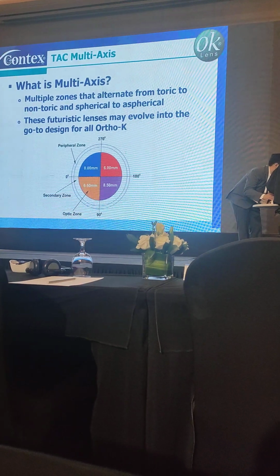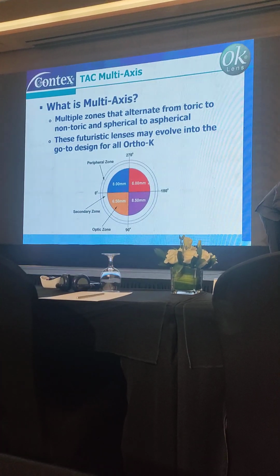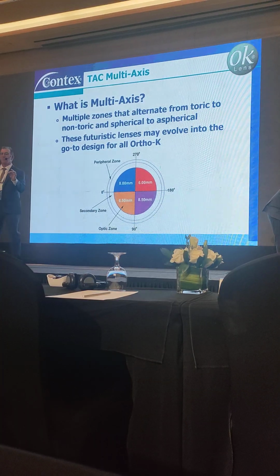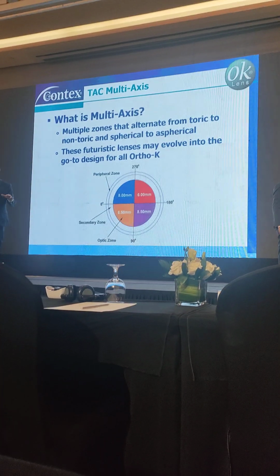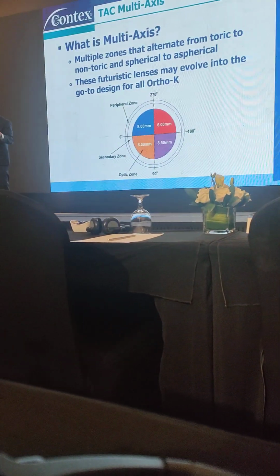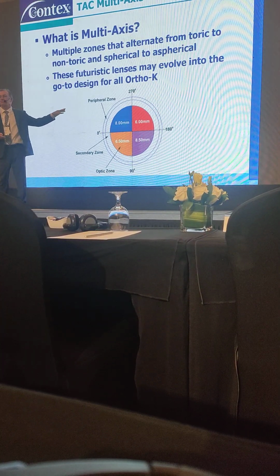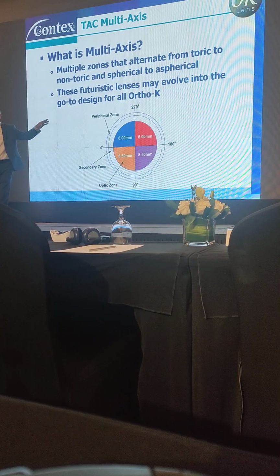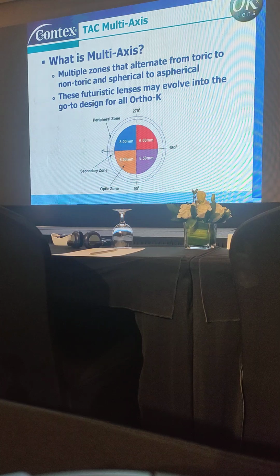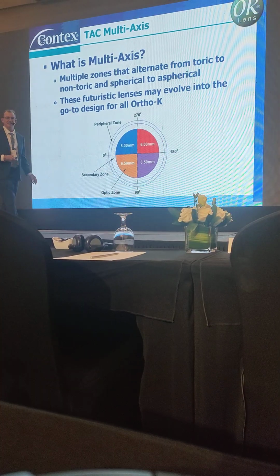More advanced. Now you get into lenses that can have 4 different curves in one quadrant. I mean, with the machines that we have now, we have the ability to put 4 different base curves inside an optic zone if we want to. When we first got this machine about 15 years ago, it's been a long time, I cut a lens with a square optic zone just to see if I could. So we made a square optic zone on a lens.